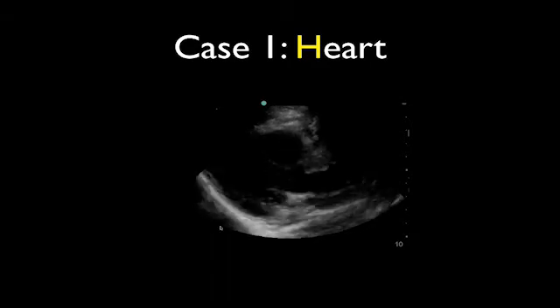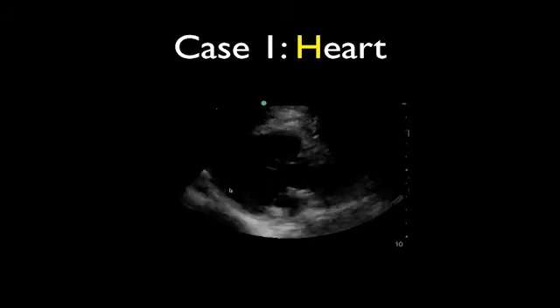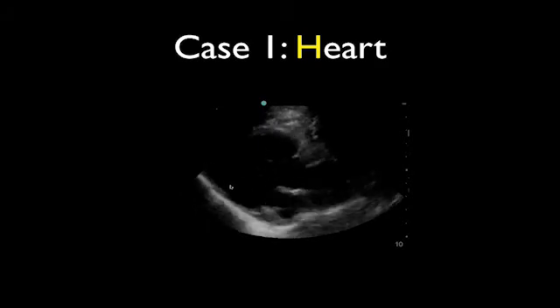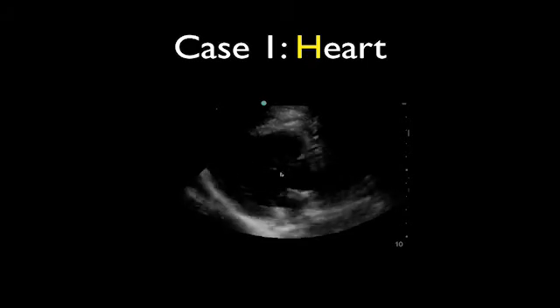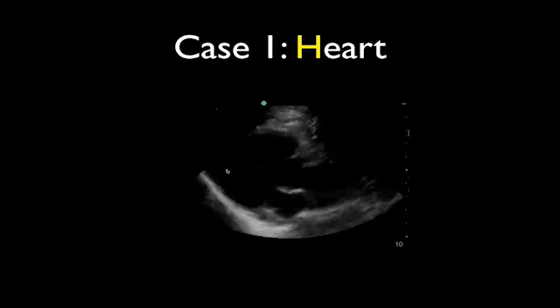Looks pretty fast, right? So it's hyperkinetic. So try and ignore the rate, but let's look at the contractility. Wall thickening, yes or no? It's kind of hard to see, but it's probably, right? You can probably see movement of the anterior leaflet, and you can see change of the size of the left ventricle. So the squeeze is pretty good, so I don't think it's her heart.